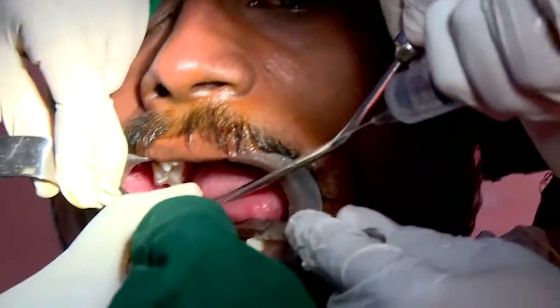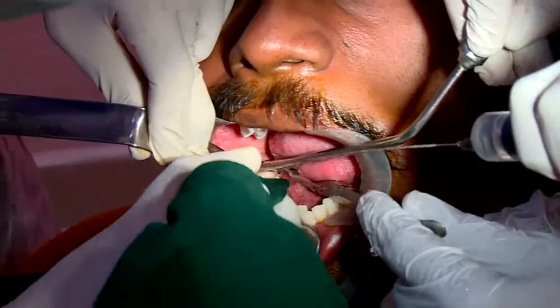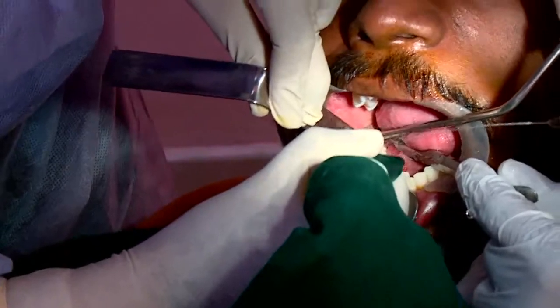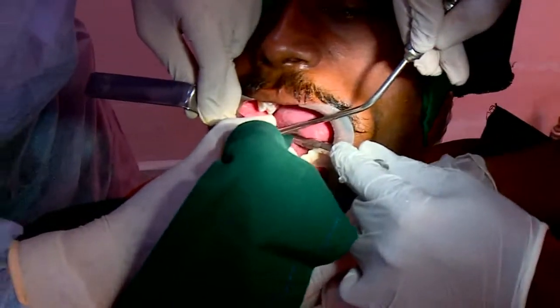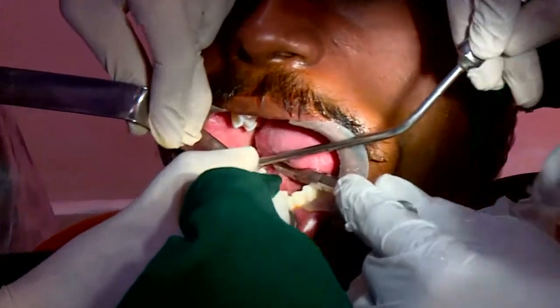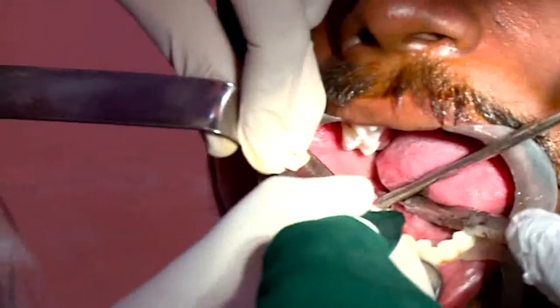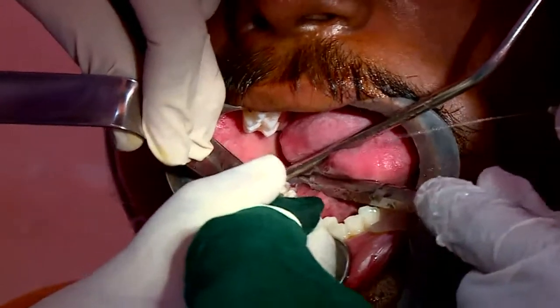Slowly as you come forward, sometimes you can damage the second molar, so keep moving forward slowly. In one or two days you will learn how to stop. So the buccal part is done. Now the distal part is going on.